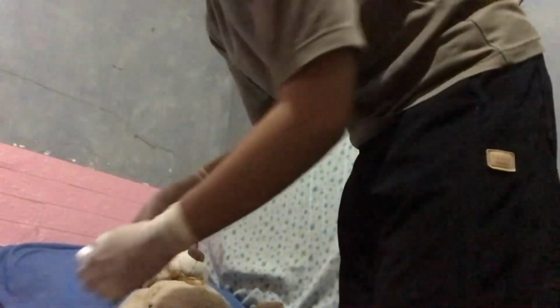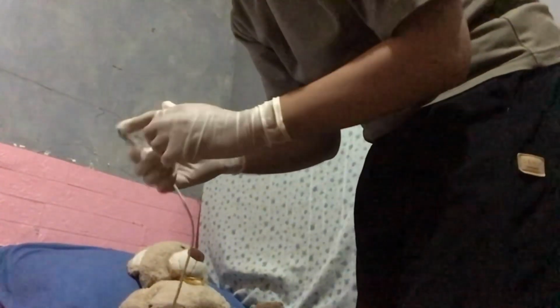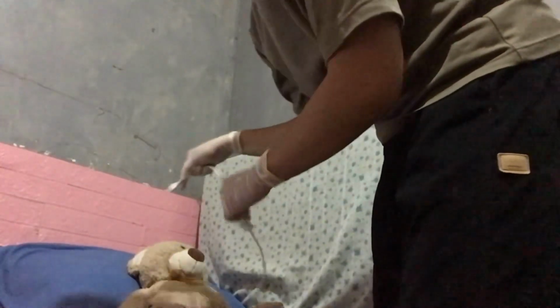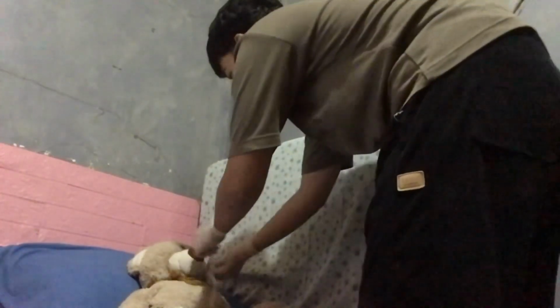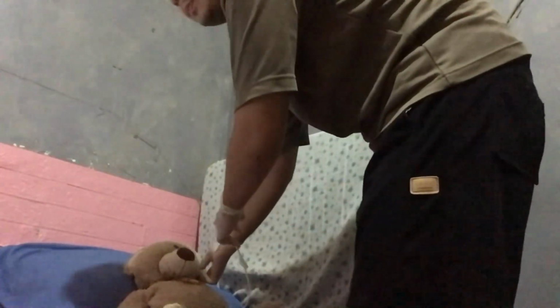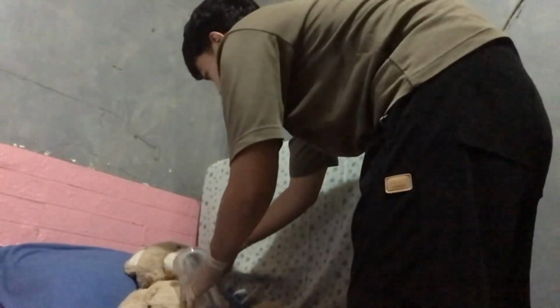Next is lubricate the tube. Lubricate the tip of the tube. Okay. Next, insert the tube through the nostrils, aiming downward and slightly backward. Gently advance the tube as the patient swallows. So this is for the cup of water.